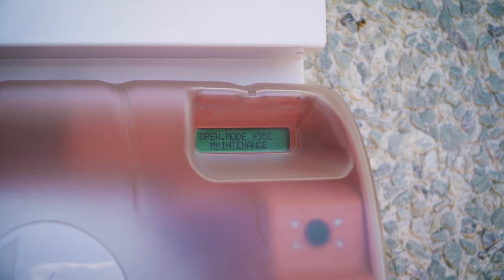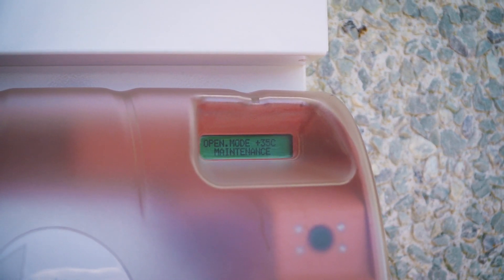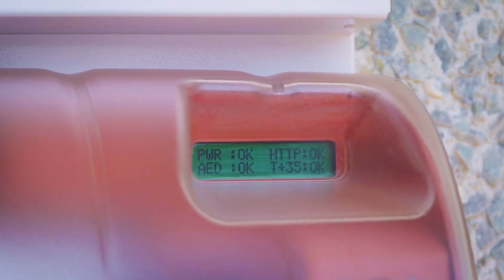When completing any task with the save station cabinet, always look for four OKs on the screen when you have finished. If you do not have four OKs, review the instruction guide to see what the error code means.